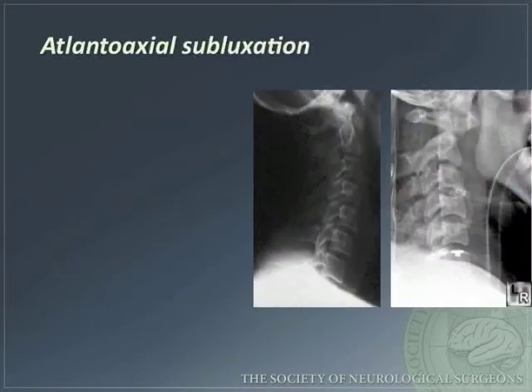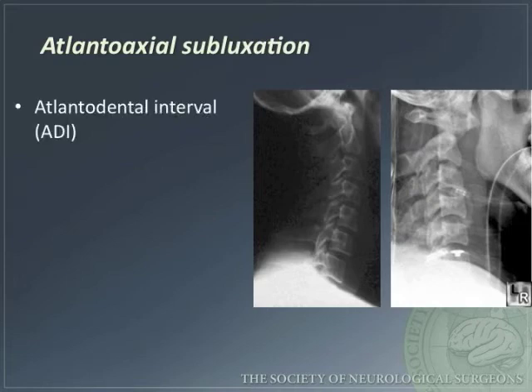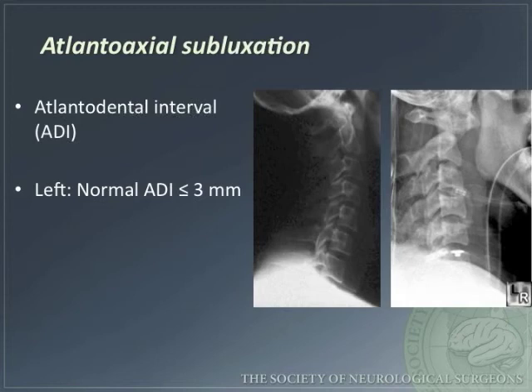Atlanto-axial subluxation is defined by the atlanto-dental interval (ADI). A normal variant has an ADI of less than 3 millimeters. On the right is an example of C1-C2 subluxation — note the expanded ADI.